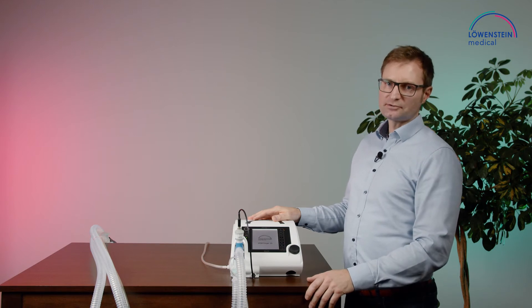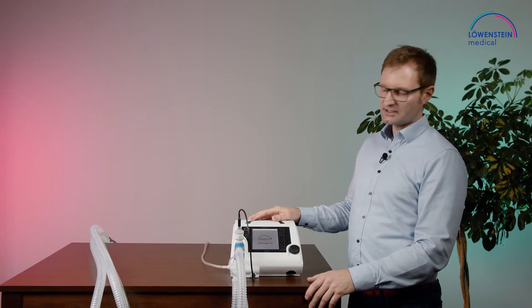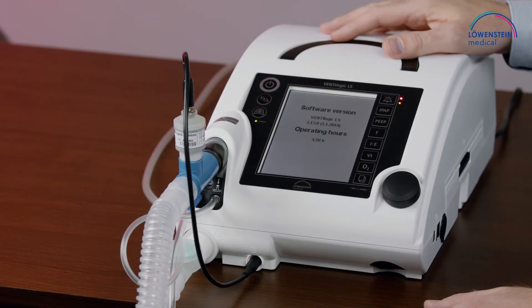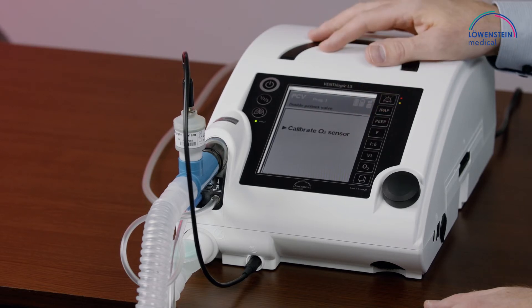To calibrate the sensor, we need to start the ventilation. The calibration is done at 21% oxygen. Start the ventilation. We got a message: 'Calibrate O2 sensor.'